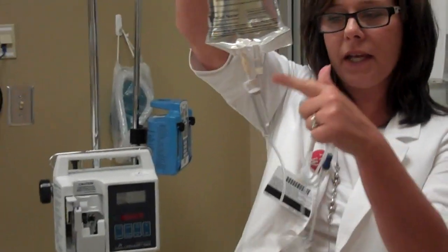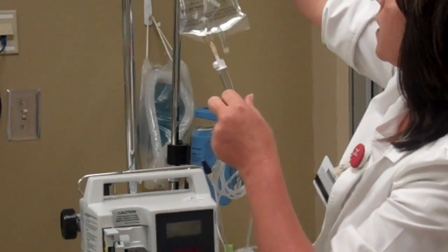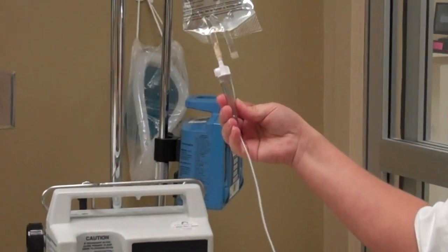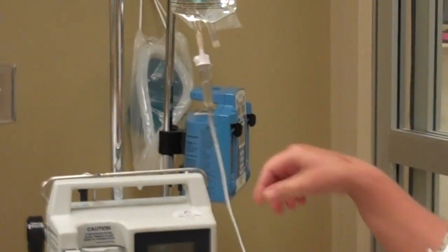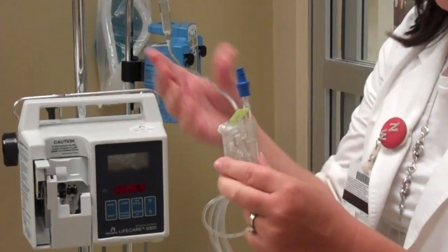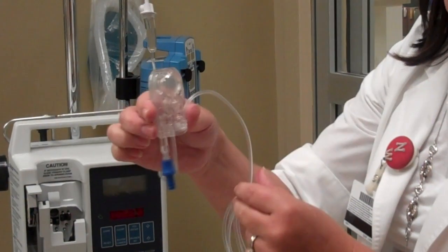You can go ahead and spike it and hang it up, and you see nothing's dripping yet. We'll get it stationary here because we're going to need our hands. We're going to squeeze the chamber to get it halfway full. With this Plum tubing, you have to prime upside down — so this is right side up and this is going to be upside down.